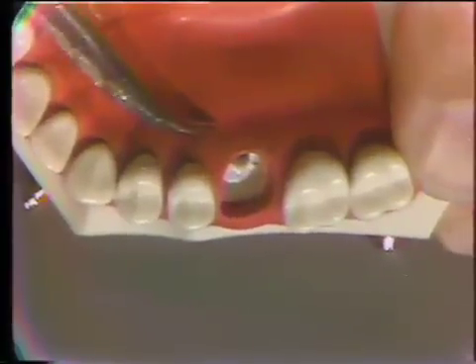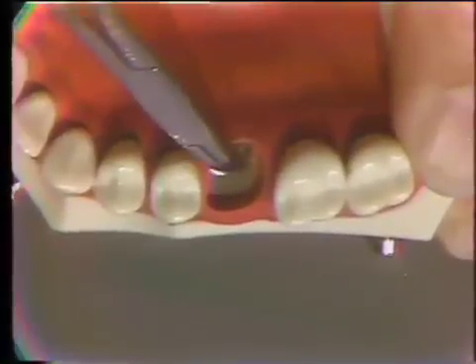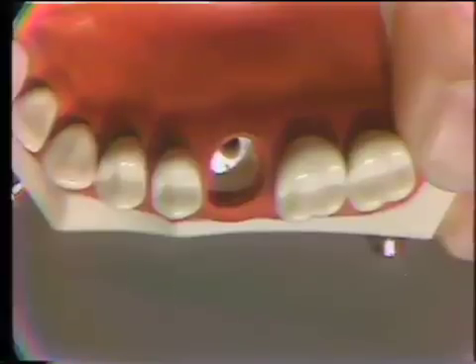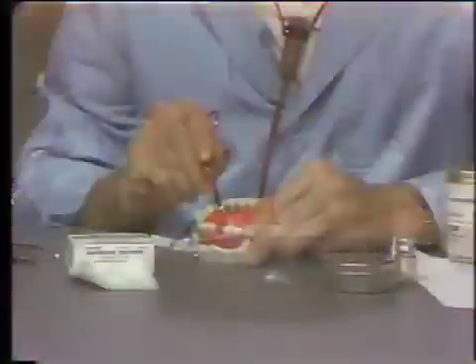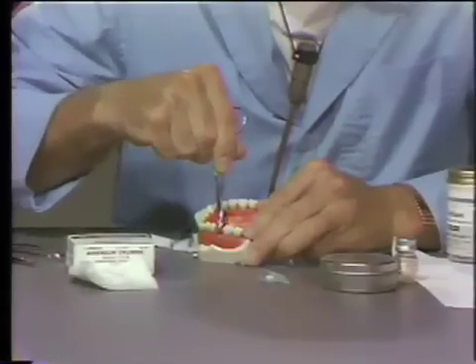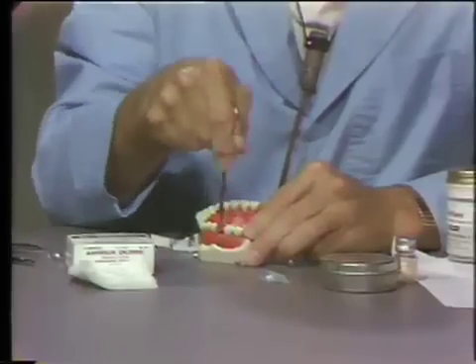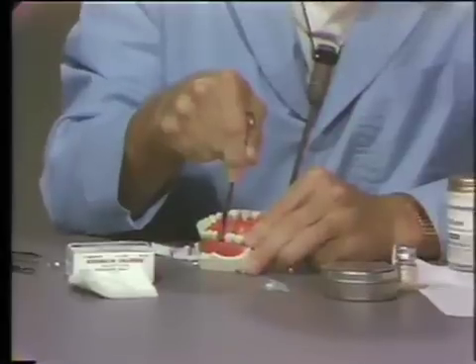In the event that bleeding is welling up from the socket, from a tear and a vascular abnormality, that tends to keep coming up. The closed end of the hemostat can be penetrated down directly over the bleeding area, and with pressure you can crush the adjacent bone matrix into the vessel opening, which will tend to control and stop it.